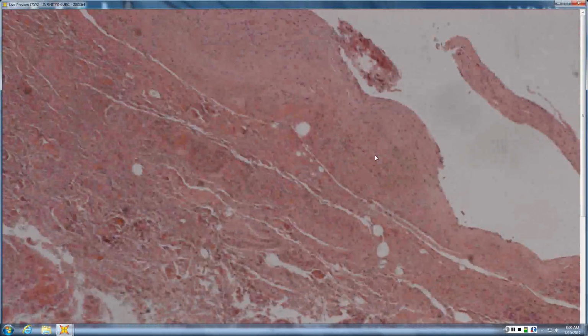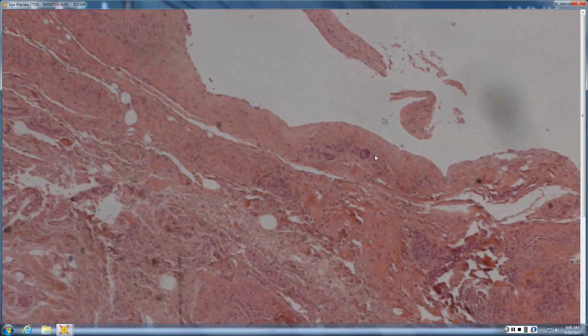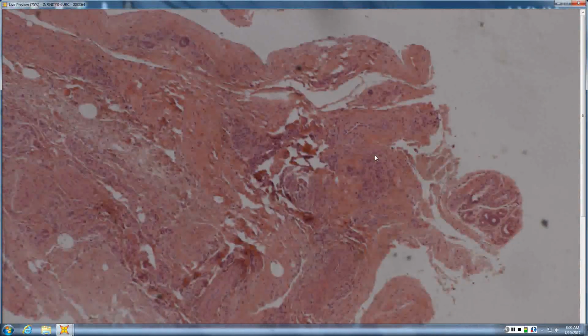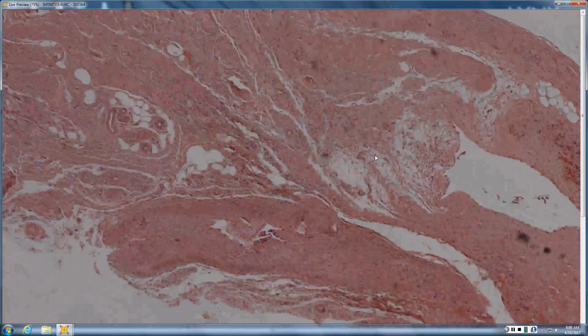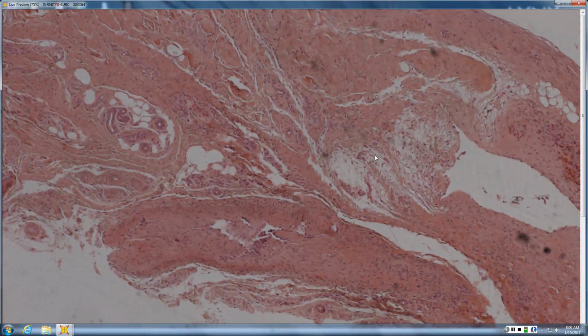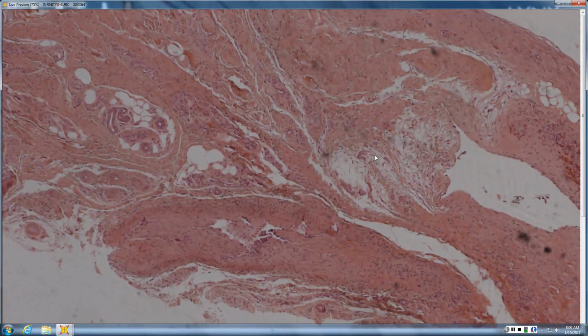So some of it could just be like a ganglion. Oh, you do have some vessels in there, though. You've got some vascular proliferation there. This thing looks like it was a traumatized vessel. So, like a traumatic AVM would also be something you'd think of.